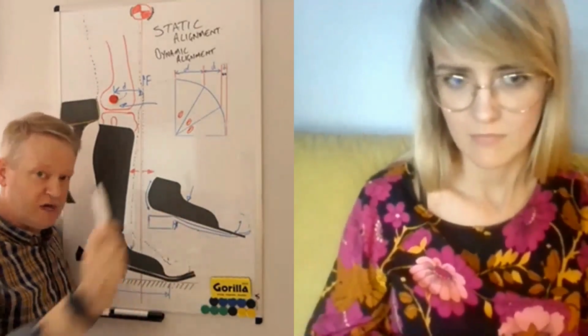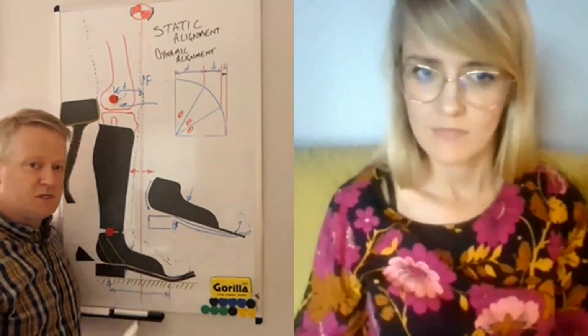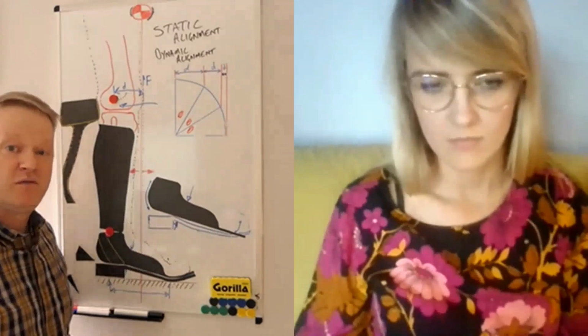We think it's not evidenced. Most of this is not evidenced, unfortunately. We need to do research, so please go and verify things. It would be great. And also, because it's higher in the shoe, this bit's harder to fit in the shoe as well. So I don't like them unless they're going in a shoe which is totally flat.